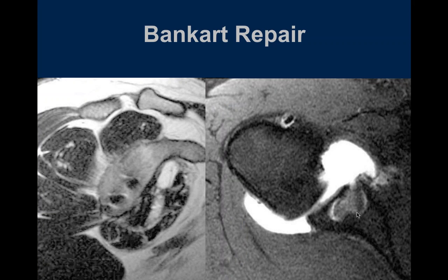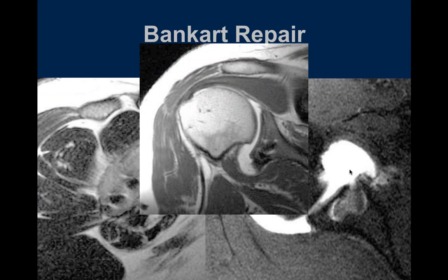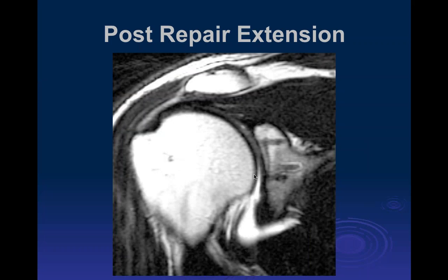this is a higher field. This is a PD FAT-SAT sequence where we can see where the suture anchors are, and we're losing visualization of the bone there due to the metal artifact from the suture anchors. And here's the oblique coronal images where we can see the 3 suture anchors down here.